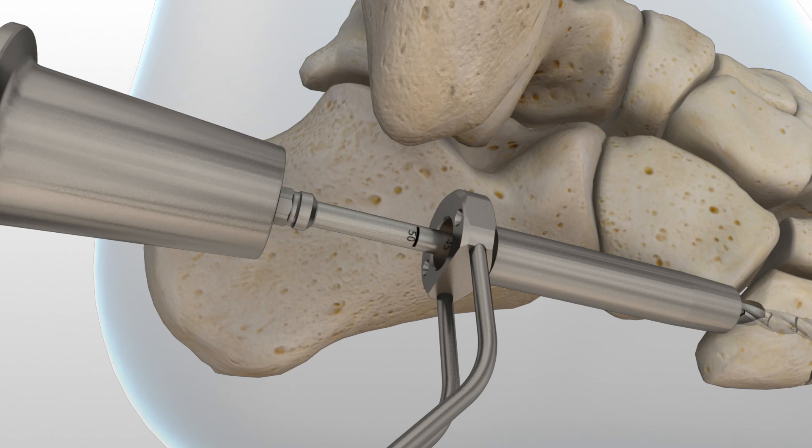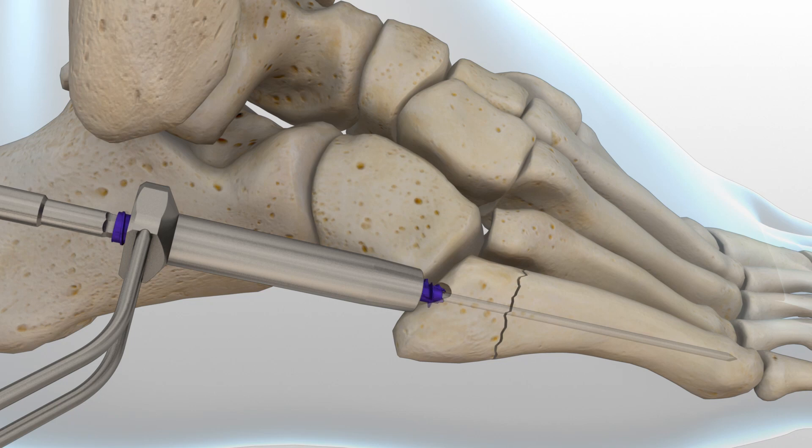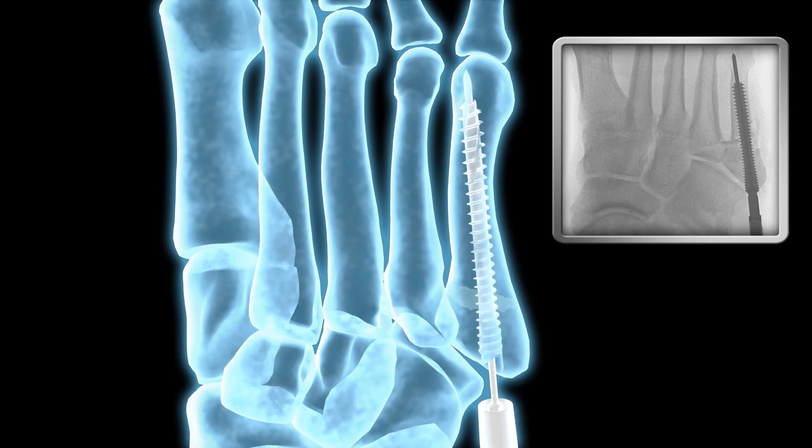Place the appropriate sized cannulated screw over the guide wire. Engage the ratchet driver to the back end of the screw. The screw is then inserted with clockwise rotations under fluoroscopic guidance until the appropriate depth is achieved.